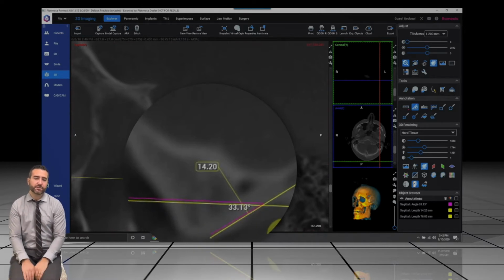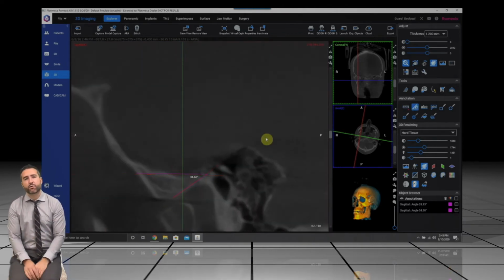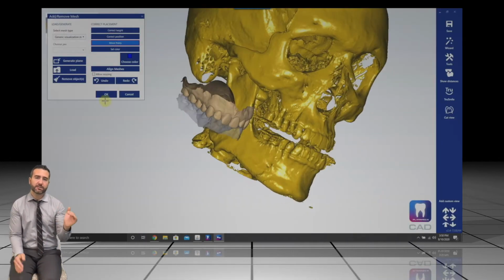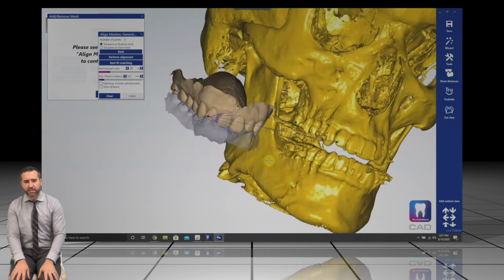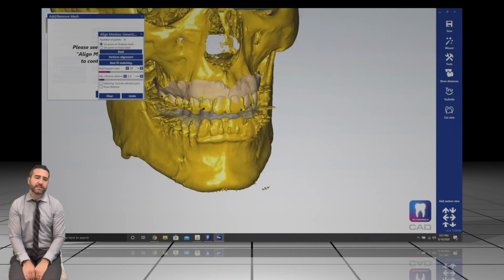I'm using this software to measure the condylar inclination that's specific to this patient. Basically, we drop a Frankfurt horizontal from porion to orbitale, and then we measure the crest of the articular eminence and glenoid fossa and drop an angle to determine this patient's specific articular inclination of their eminence.